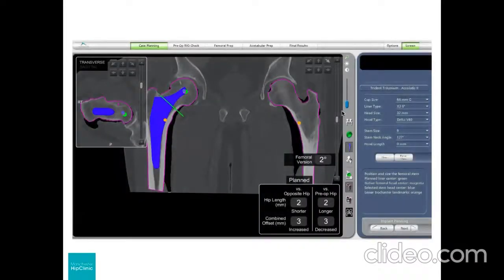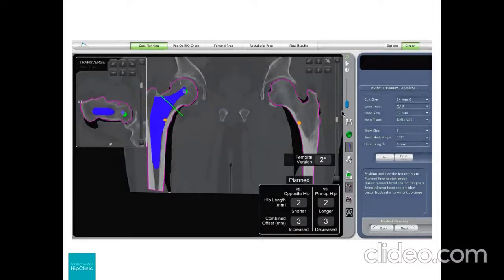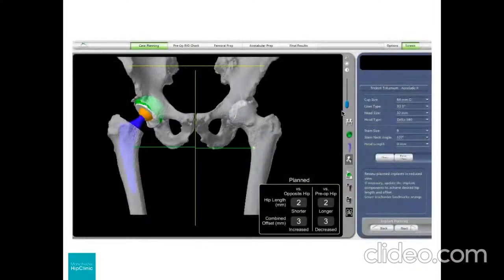And then while we're doing it, we can check to make sure everything is right. And then at the end, when all the bits are in place, we can measure exactly what that leg length is, what the muscle balance is, and we can make any final tweaks we want to at that last minute before we close up and the operation is over. So all the way through, there's absolute precise control of what we're doing, and that's the whole point of robotics.